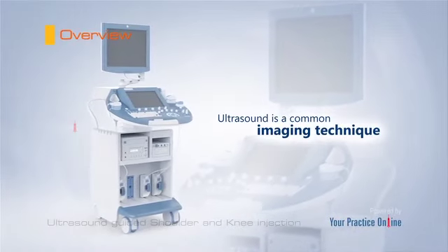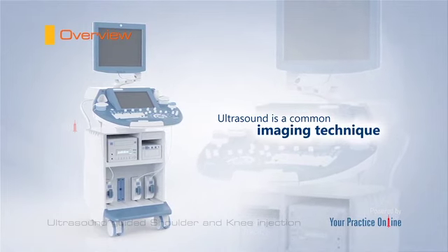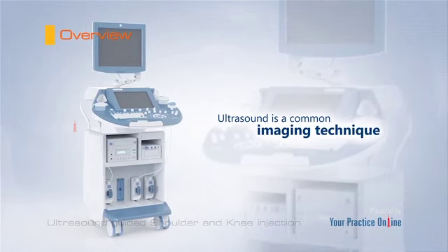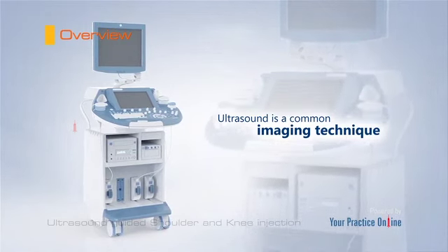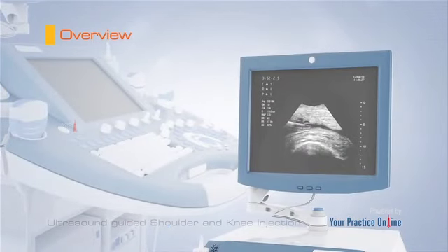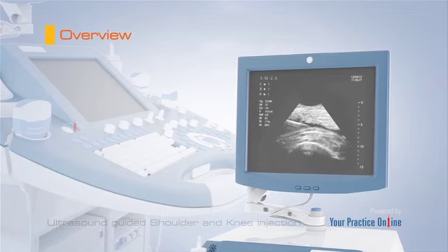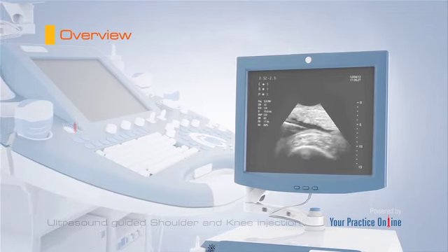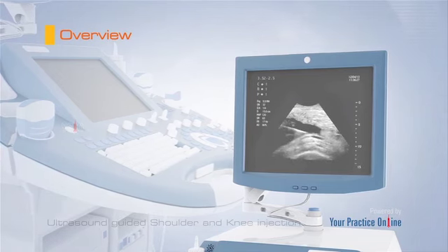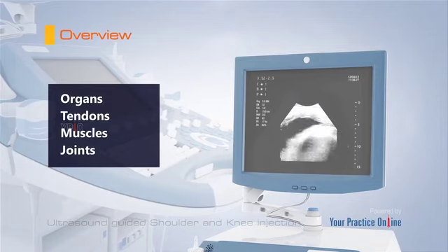Ultrasound is a common imaging technique that employs high-frequency sound waves to create images of organs and other internal structures of the body. These images provide valuable information of underlying pathology of the tissues and assist with diagnosis and planning the treatment of a particular condition. Ultrasound provides a clear view of the organs, tendons, muscles or joints, and any associated disorders.